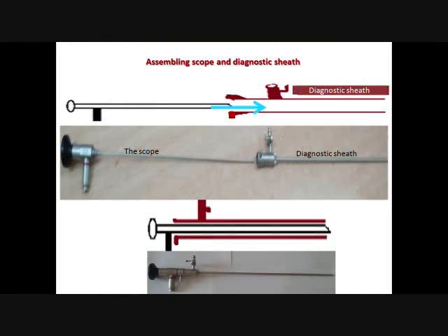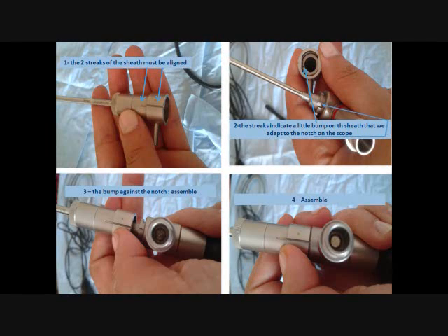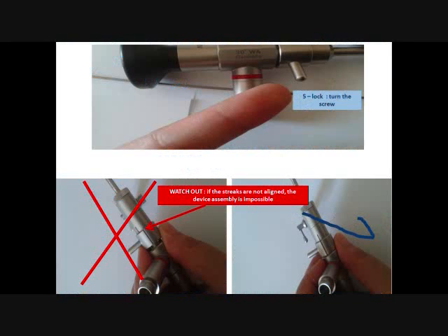And here's how we assemble the hysteroscope with its diagnostic sheath. We put it inside the sheath and we lock. To assemble them, notice the 2 streaks on the sheath that we first have to align. Once aligned, they correspond to a little bump right there on the inner side of the sheath. We will adapt it to the small notch on the scope, and there it goes, the 2 are assembled. At that moment, we turn the small screw and we lock the 2. They can no longer be detached. Just pay attention to the streaks. If not aligned, there's no way the device is assembled.